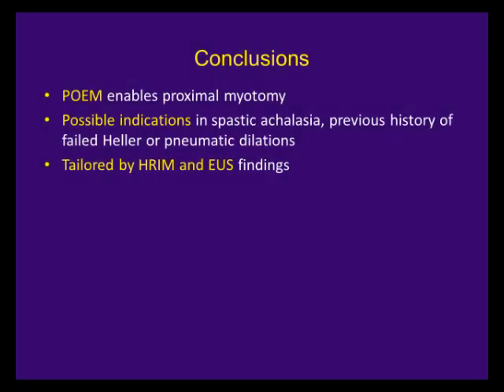In conclusion, POEM, by its endoscopic nature, combined with diagnostic information provided by high-resolution manometry and endoscopic ultrasound, allows for a tailored surgical management of achalasia. It enables more proximal myotomy in patients with submucosal or muscular findings, proximal spastic segments, or failed prior treatment modalities.